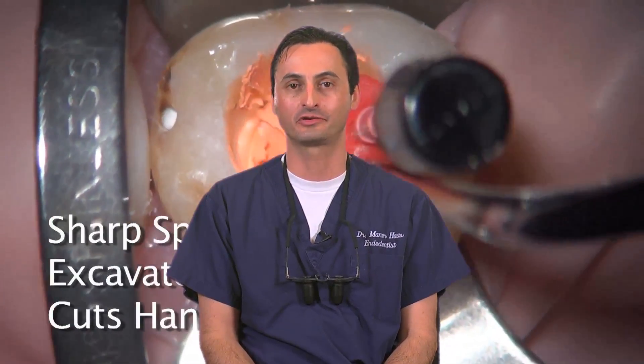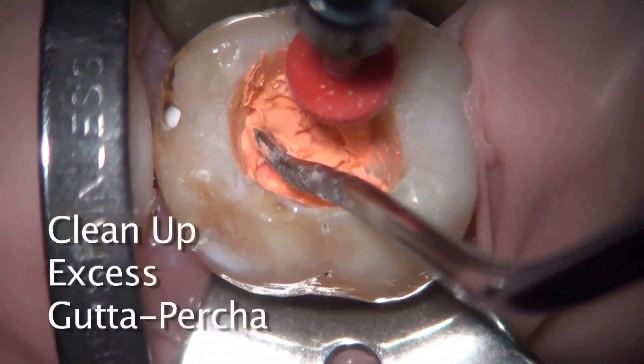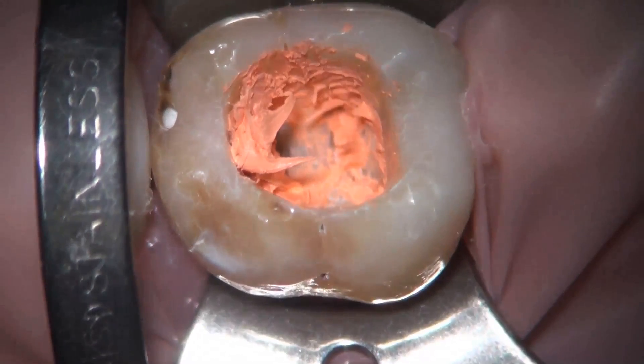And so to recap, removal of the gutta core carrier and warm gutta percha is very simple and unique to gutta core. You may use any technique you wish, including round burrs, but I found the hard way that I don't like using burrs, especially high-speed burrs, and that a sharp spoon excavator works best.